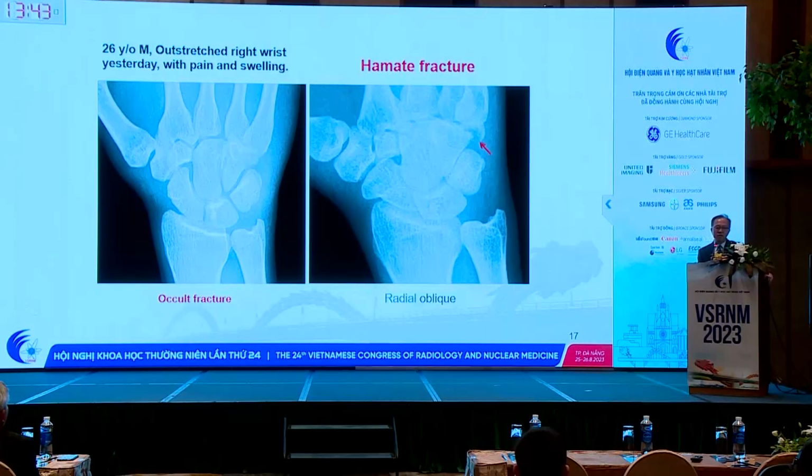They have to identify which part is painful so that he can order the next X-ray. If the clinicians don't have any time to do the physical exam, they send the patient to the emergency radiology center, and then it will mimic so many cases. It will mistake so many cases because we do screening.